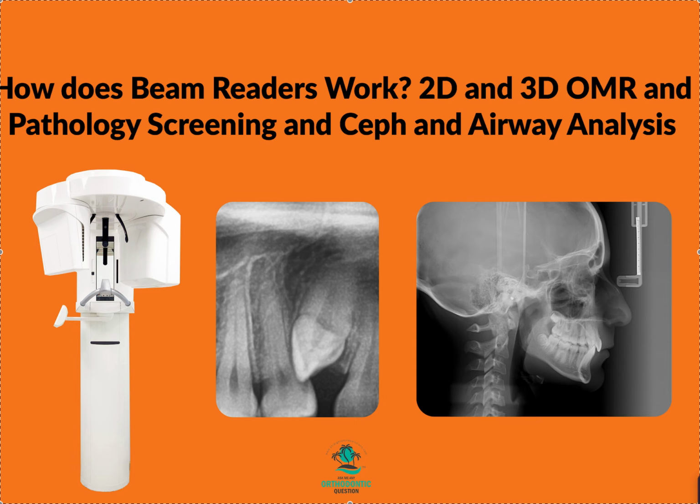For ortho, you've seen some of my other reports, whether it's a supernumerary tooth, an impacted canine, or some random strange pathology that shows up. For ortho, the same thing goes. You do not want to start moving teeth unless you're sure you're in the clear to move them, especially if you're doing braces, because you have no control in braces as to how things move.